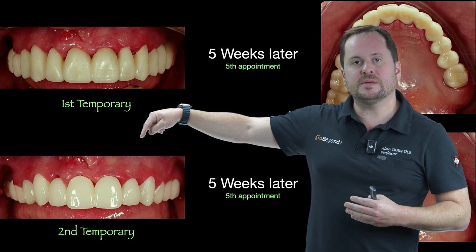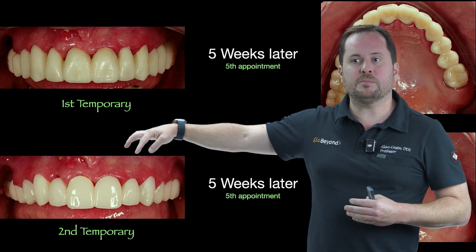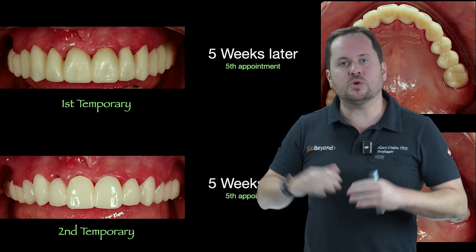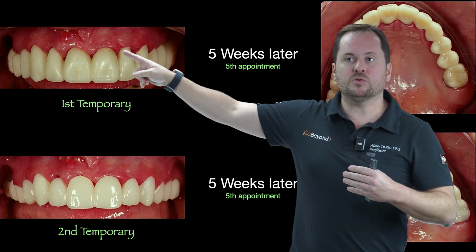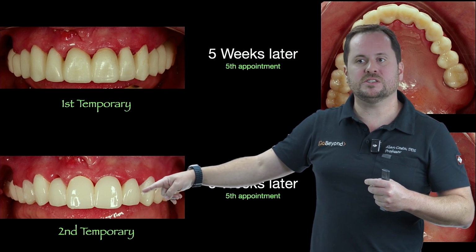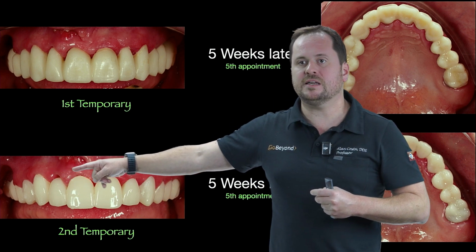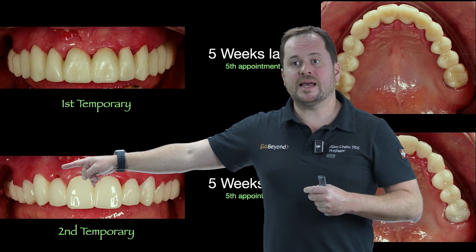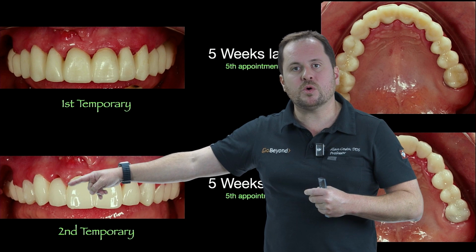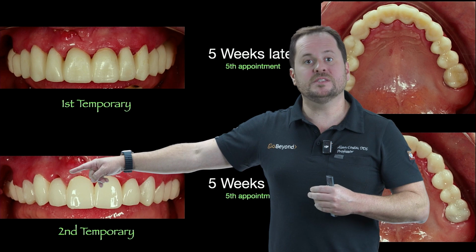Look how beautiful, the second set of provisionals. Using the same BioCrown resin, we made the impression with all the improvements in the delicacy of the tooth size. The patient was short, a small patient, and this type of tooth shape you see here in this region didn't suit her. She matched much better with this shape. That region of the papilla, the cervical area, which we are seeing here on this patient's lateral side, and then this space being intentionally left, hoping that the gum might descend a little more to create an improvement in the zenith, in the profile there on the lateral side.